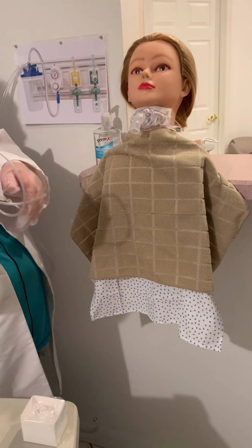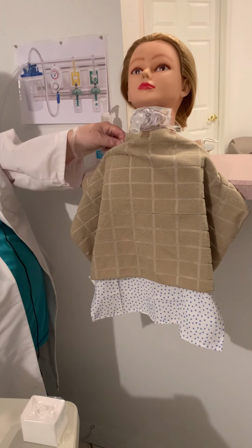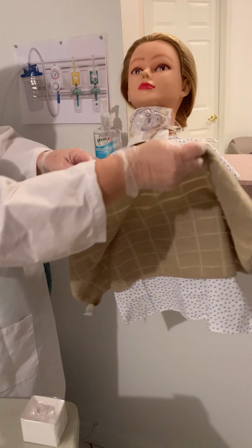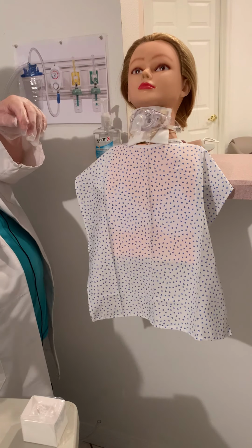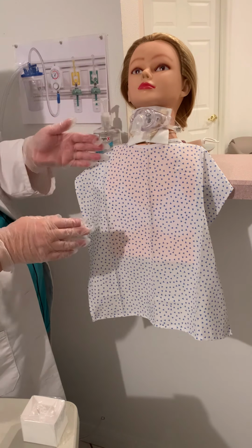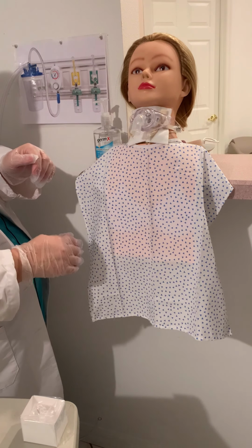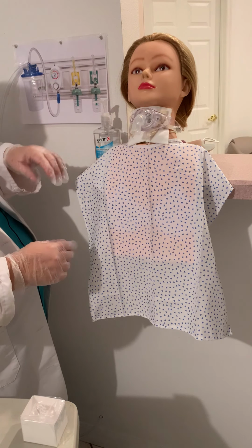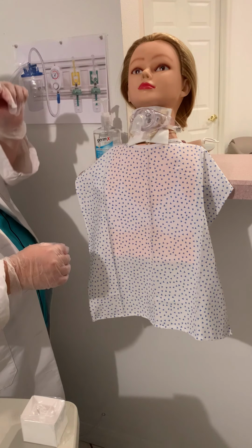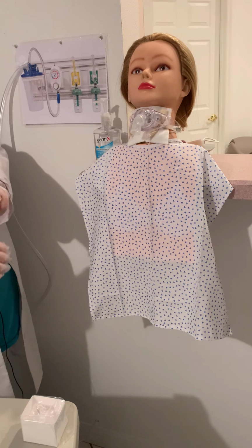Okay. And then we can go ahead and throw this away. We can take the towel off her chest. Okay. We can reposition her for comfort. Usually not going to be supine, usually upright. We'll make sure we put the side rail back up, bed in the low position. When her oxygen's doing great, we'll go ahead and turn the oxygen back down to her normal level. And then we'll discard our supplies.